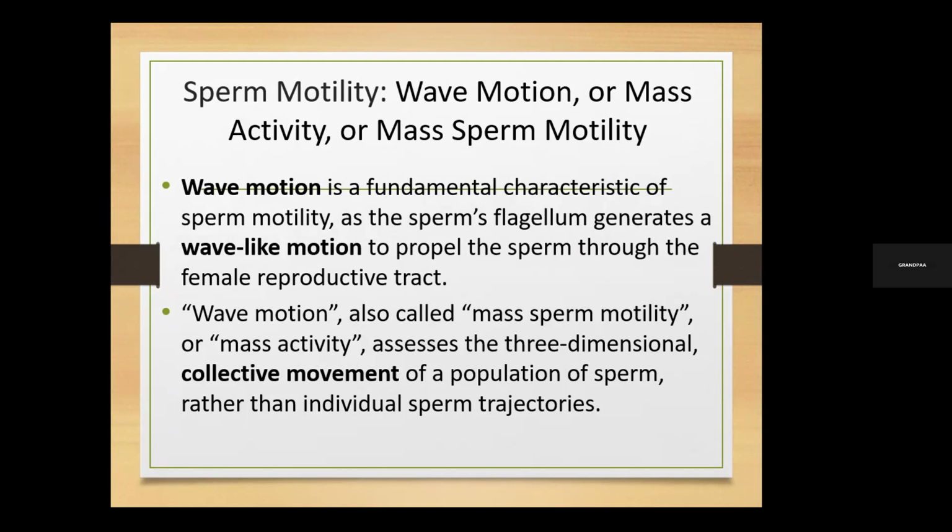So we're going to introduce what we call wave motion. Wave motion is not a parameter for assessment in semen analysis. Take note, it is not, but it is a step that will help you have a fair idea about the sample you are going to work on, especially with respect to motility.